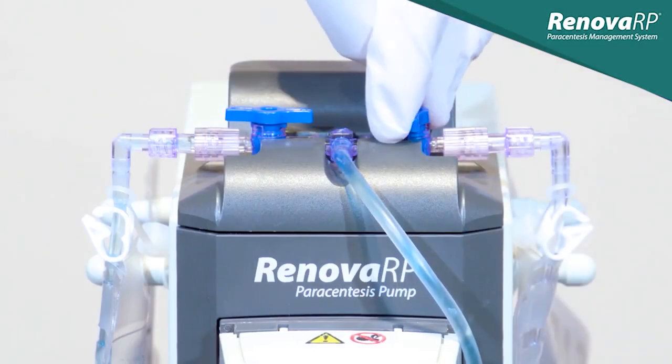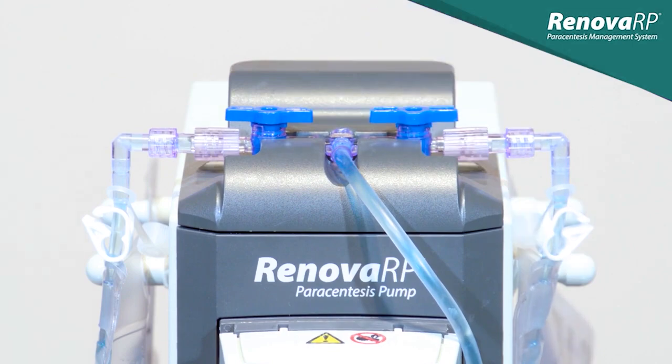As the first bag nears capacity, we open the stopcock to the other bag. Now both bags will be filling slowly.